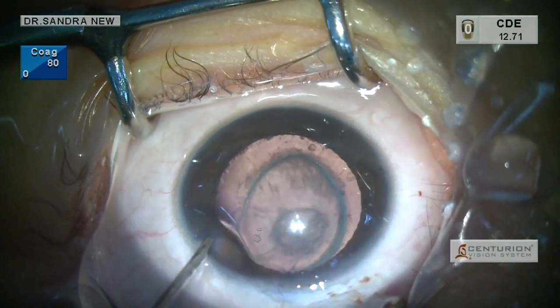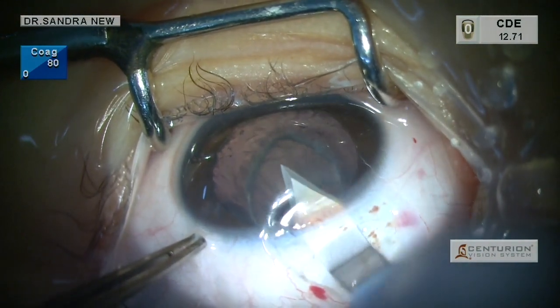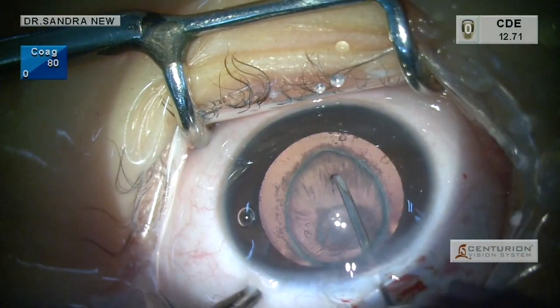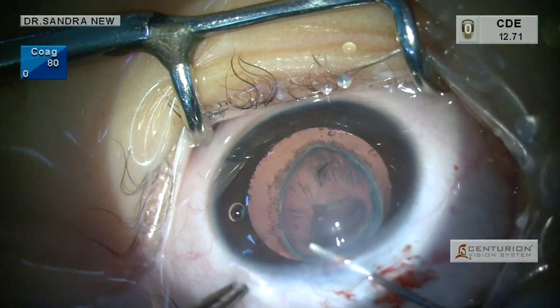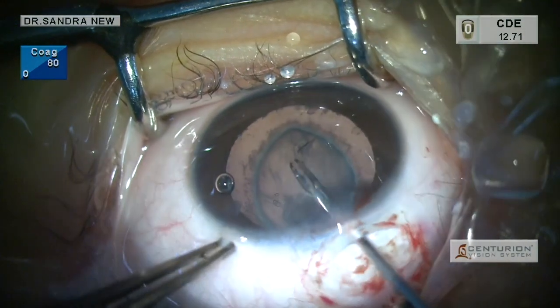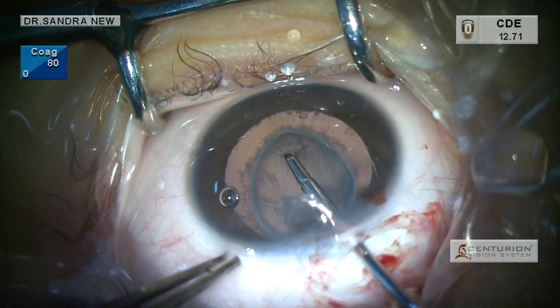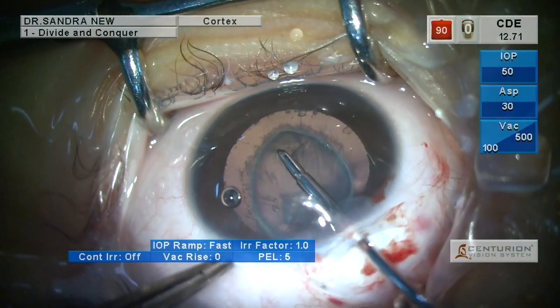The side port is made and after injecting viscoelastics, I am using a 2.8 mm keratome to enter the anterior chamber. The anterior capsule nick is made with the help of a 26-gauge needle and after filling the anterior chamber deeply with viscoelastics, I am using a microrexis forceps to grasp the torn edge of the anterior capsule to fashion the rhexis.